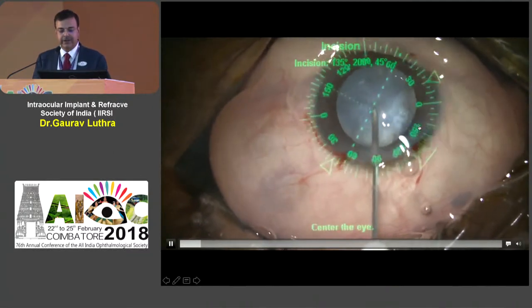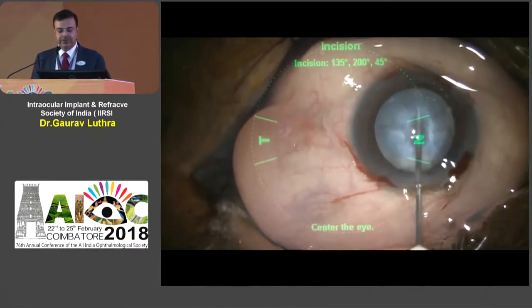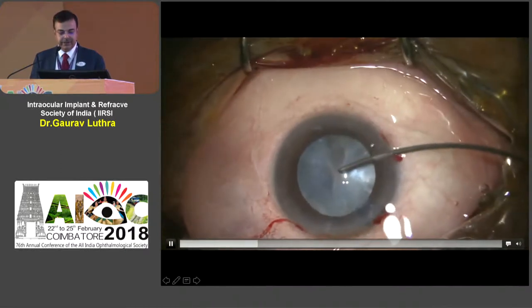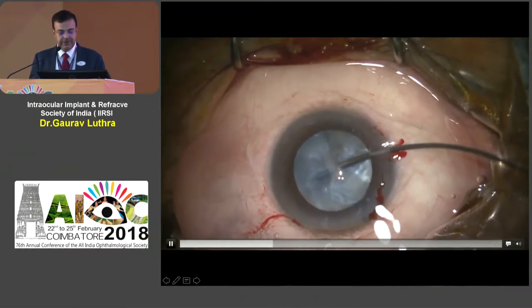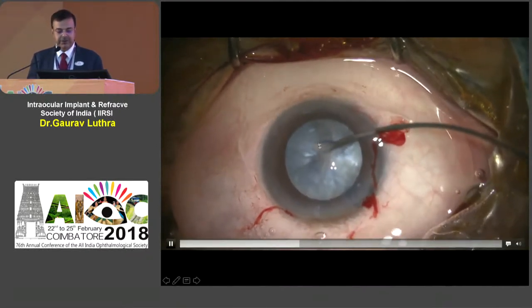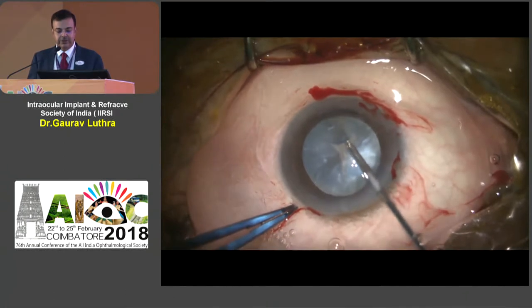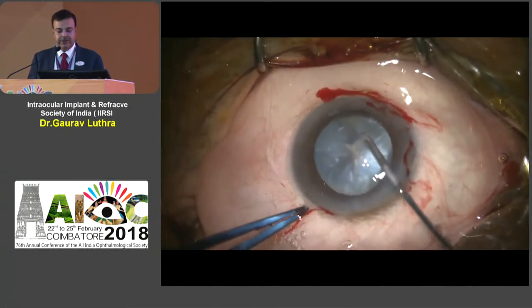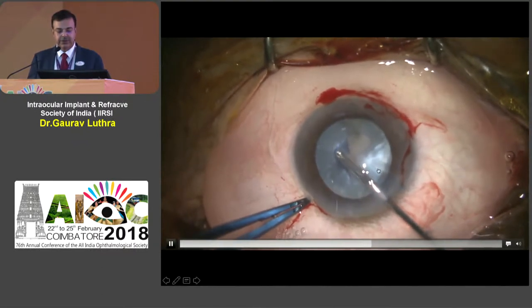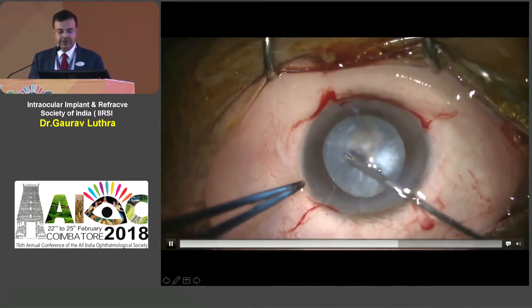Sometimes you will be faced with an intumescent cataract. Here I'm going from a paracentesis with viscoelastic in the eye; as I try to aspirate there is sudden shallowing and I end up causing a break in the rhexis. This is a funny-shaped break — a tripod kind of thing — broken in a tram-track way: one here, one here, one here. It's a very intumescent lens. Now I have to try and retrieve it by picking it up from one point and running around all three extensions. There is always a risk these will extend, so you must ensure good viscoelastic is in the eye.